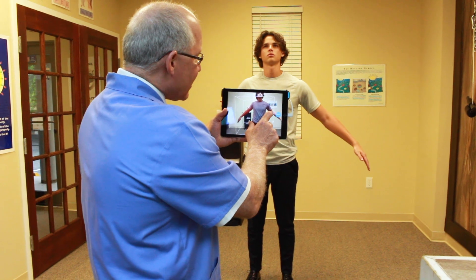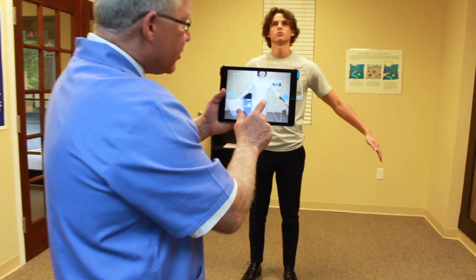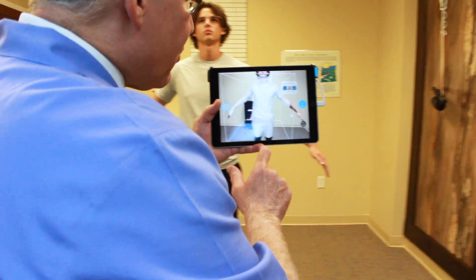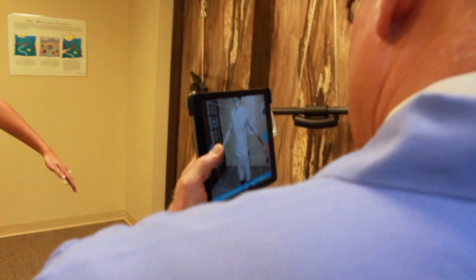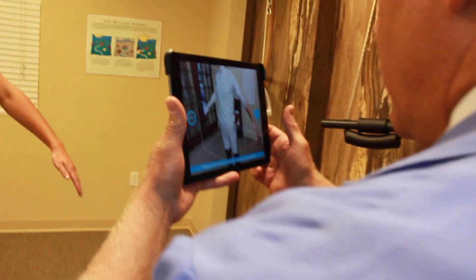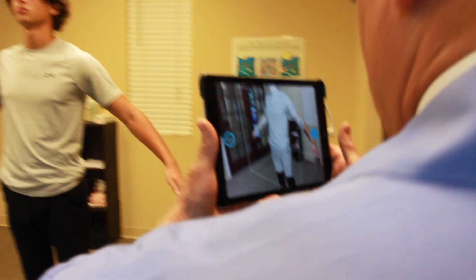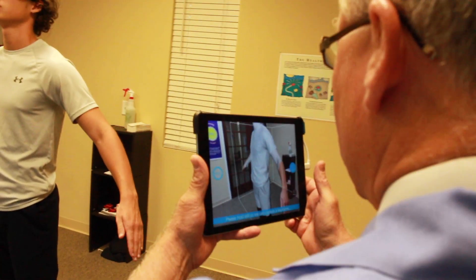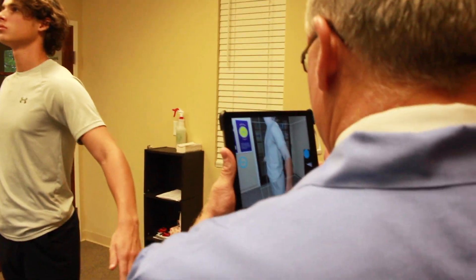We're going to create a box around them. I hit scan and it's going to start to create the three-dimensional image, similar to a hologram, and then we use that information to create the three-dimensional scolibrace.